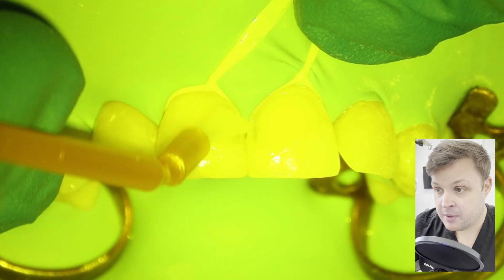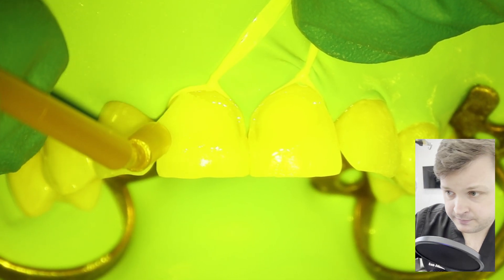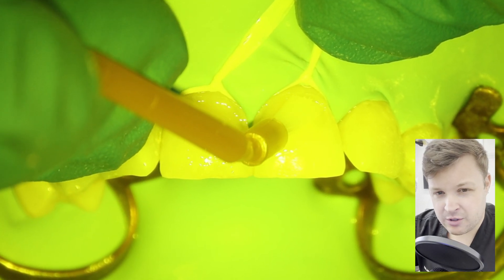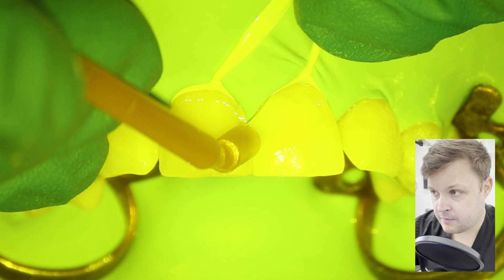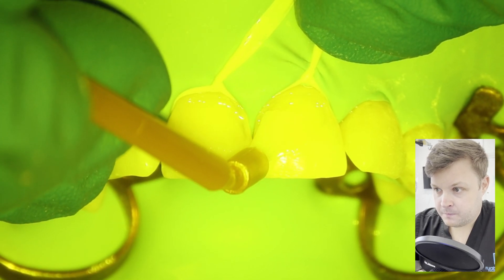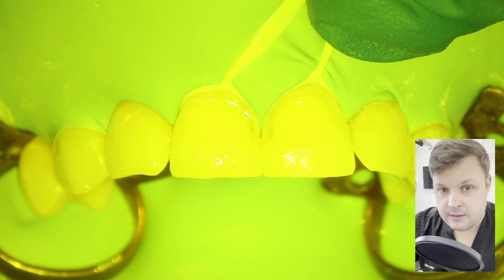Now I am using bond — I'm using iBond here. I'm massaging it and really pushing it into the cavity to make sure it's well applied, then air drying it.